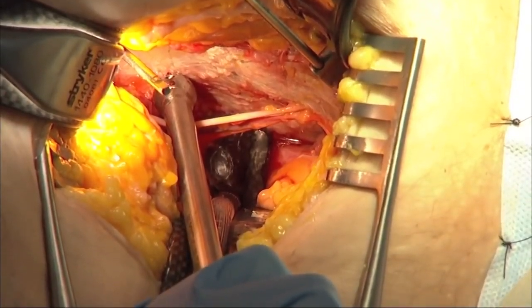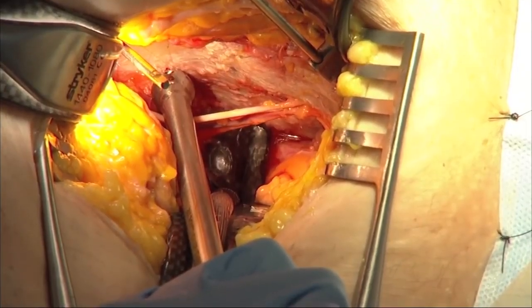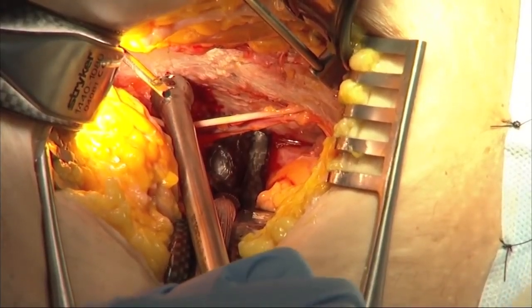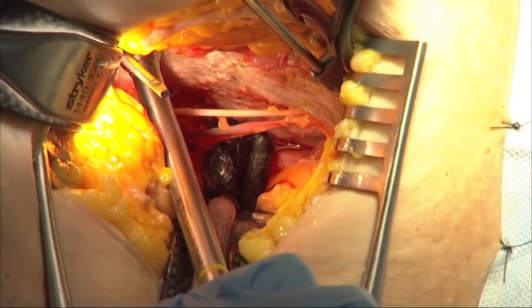We can measure right off of the cannulation in the spiked screw inserter with measurements on the drill bit so that we know the length of the screw and the depth of the drilling. And once we have it drilled and measured, we actually take the drill out, the inner cannulation out, and then that allows us to place the screw right in the spiked screw inserter.